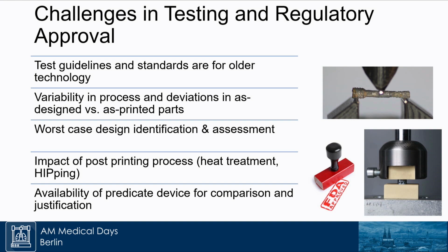Obviously, if you have a big chunk of metal and use that for testing, and you have a 3D printed open lattice structure, the lattice is not going to be as strong. It doesn't hold up to the same level of load. So that's a challenge. Those standards need to be updated. I was on a call with the FDA 2 weeks ago. We discussed that. They were getting this information from the suppliers.